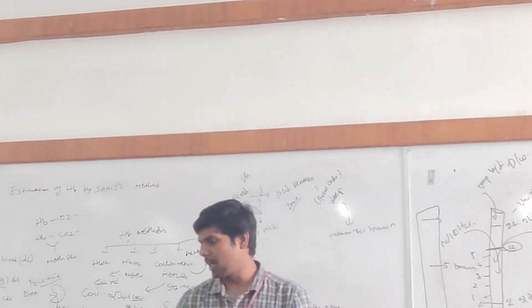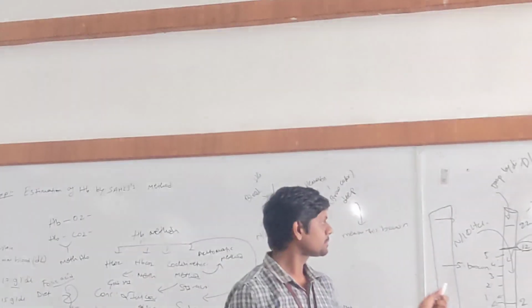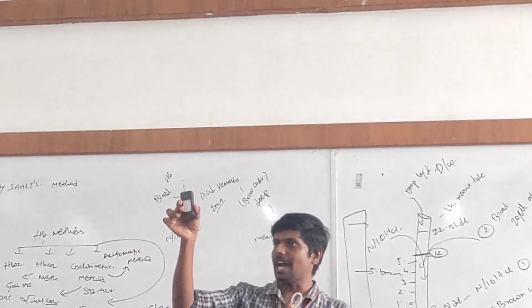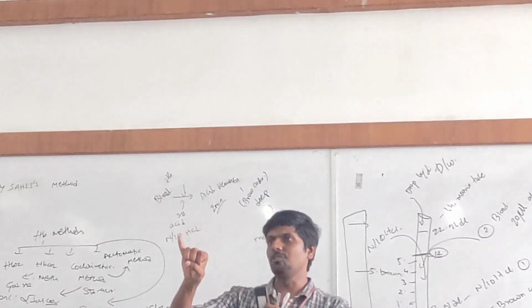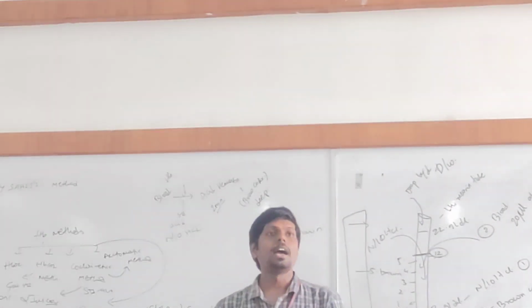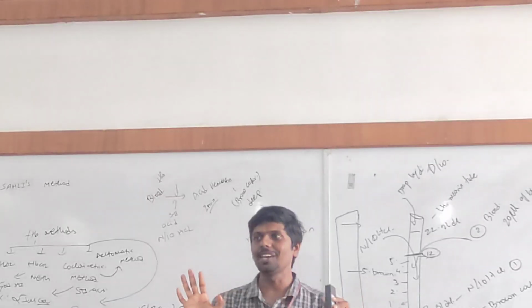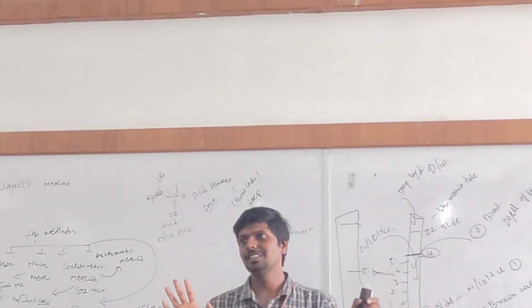So what are the components of the apparatus? We need an HB tube, an HB pipette, an HB stand, then a stirrer to mix it, distilled water, and a reagent. What reagent is it? N/10 HCl. Until your death, you must remember these values. N/10 HCl, okay? If anyone asks what reagent we are using in HB, it is N/10 HCl.